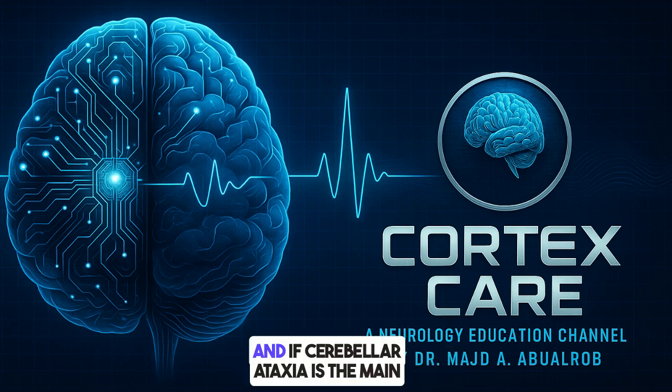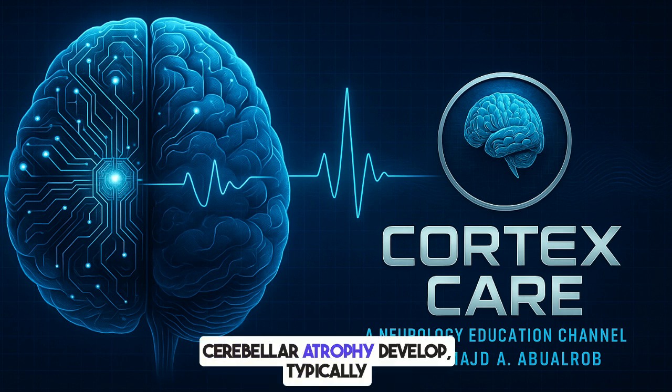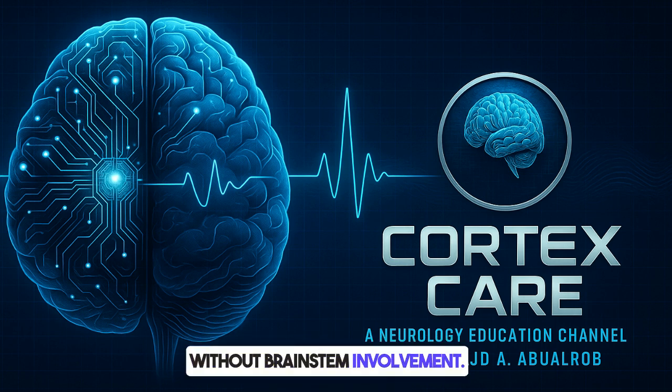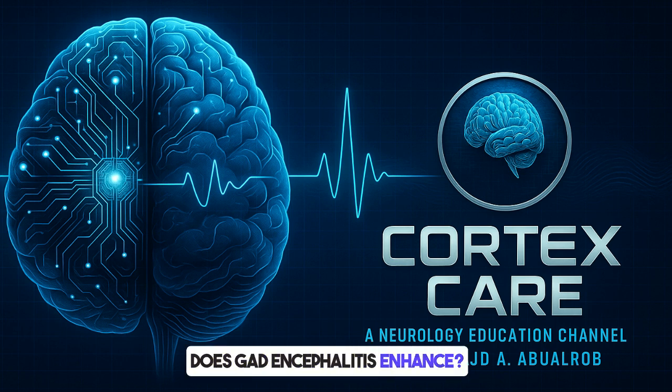It seems so. And if cerebellar ataxia is the main feature, you might see cerebellar atrophy develop, typically without brainstem involvement. The paper notes no specific MRI patterns have been reported just for the stiff person syndrome presentation. Okay. And contrast, does GAD encephalitis enhance? Some cases show faint contrast enhancement of those medial temporal lobe lesions. Not always, but it can happen.